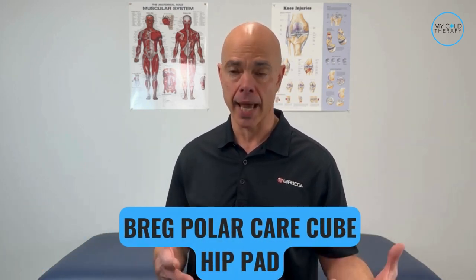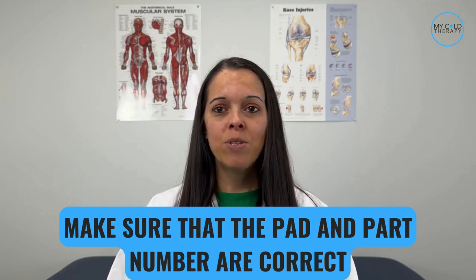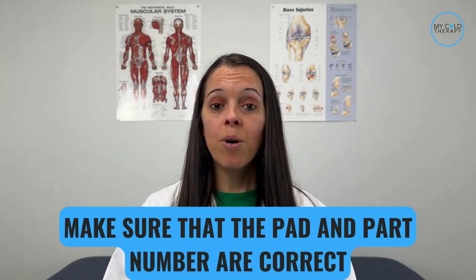Alright, how do we do this? Michelle, take us through the steps of the application of the Bregg PolarCare Cube Pads. The first thing we need to do is make sure that the pad and the part number are correct. You would do this by looking at the front right corner of the pad, where the part number will be listed on the white label.